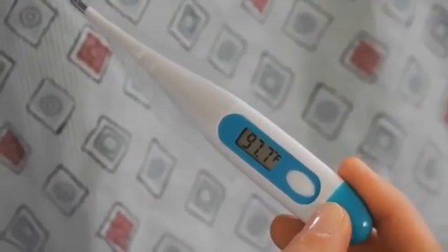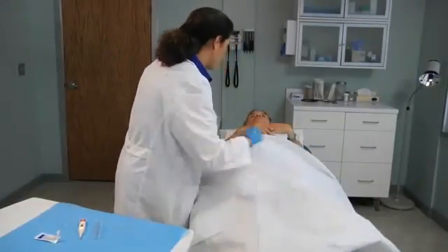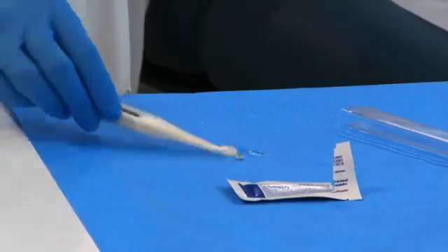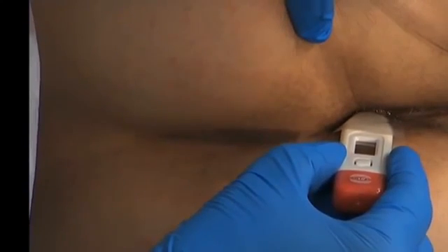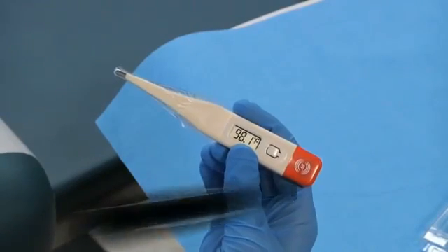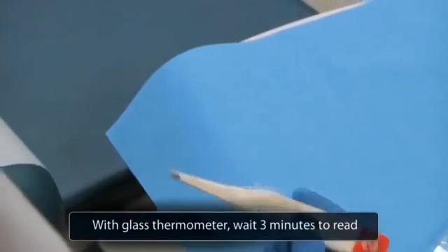Most patients prefer oral to rectal temperatures. However, taking oral temperatures is not recommended if patients are unconscious, restless, or unable to close their mouths. In these cases, rectal temperatures are advised. For a rectal temperature, ask the patient to lie on one side with the hip flexed. Lubricate the tip of the thermometer. Insert the thermometer about 3 to 4 centimeters, or 1.5 inches, into the anal canal in a direction pointing to the umbilicus. Remove it after the recommended time period, then read. As opposed to this electronic thermometer, the process with a glass thermometer is the same, although you must wait 3 minutes to read the results.